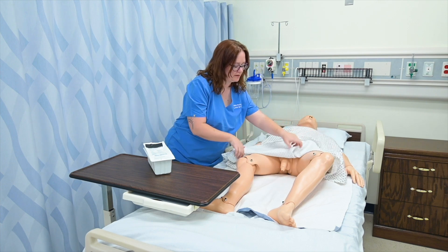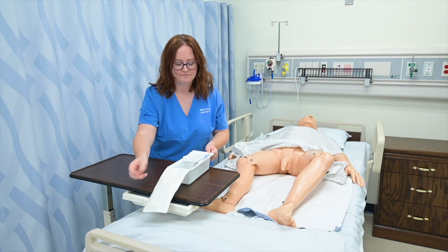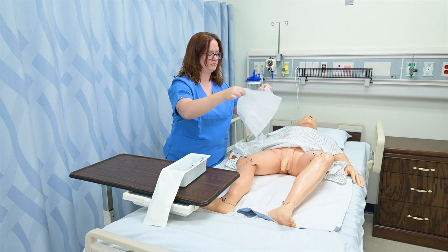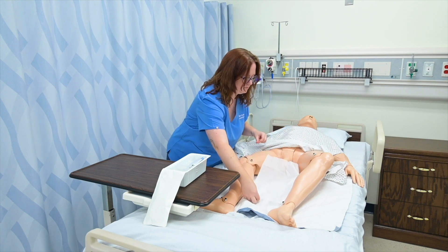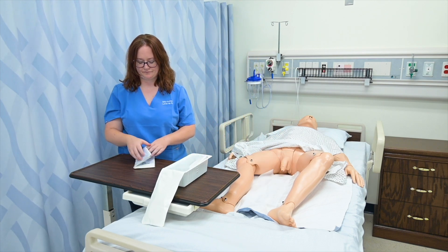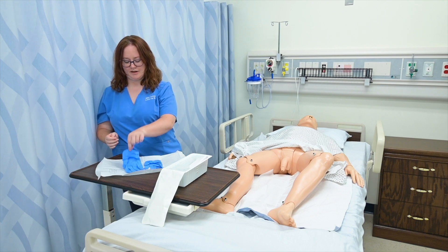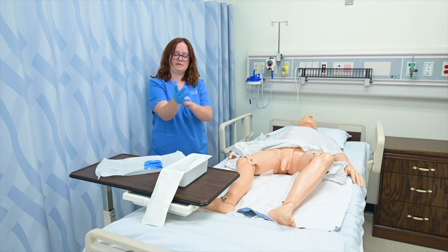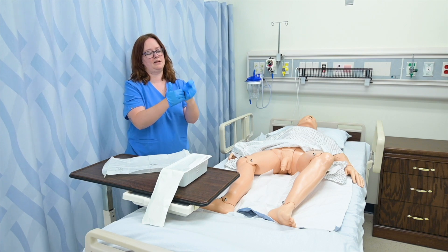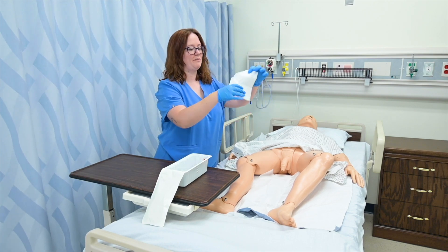I'm going to pull his gown up so that he'll be ready once I finish opening my kit. I'm going to open this kit, grab this top drape, and place it under him. Then I'll grab my gloves — grabbing that cuff of my dominant hand with my non-dominant hand, tucking into my non-dominant glove with my dominant hand, keeping that thumb out and removing that packet. And then grab my fenestrated drape.